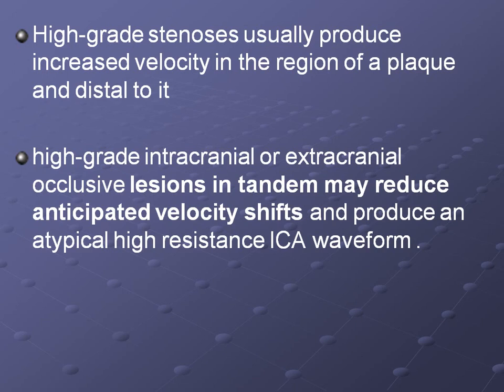Peak systolic velocity is normal, but end diastolic velocity gets very low, like the external carotid artery. With an occlusion you should see an occluded artery, an occluded lumen. Here the lumen is patent, everything is patent, but there is only a high resistance flow pattern in the ICA. That's what we call tandem lesions, vague lesions, ill-defined lesions.